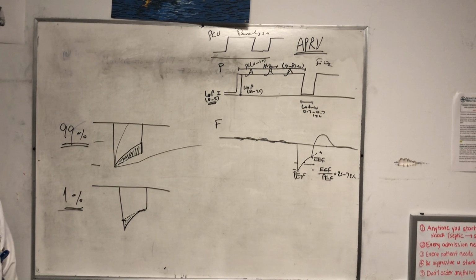And the reason is, it's another claim to fame for this mode, which is that it does prevent bronchospasm. It doesn't allow the bronchospasm to happen.